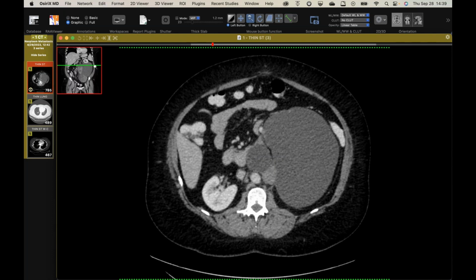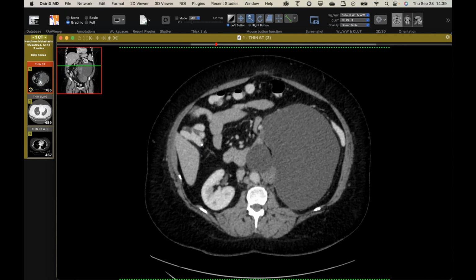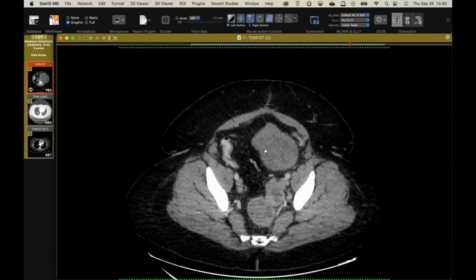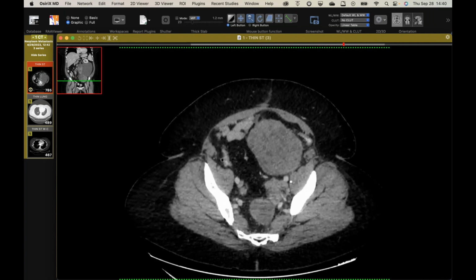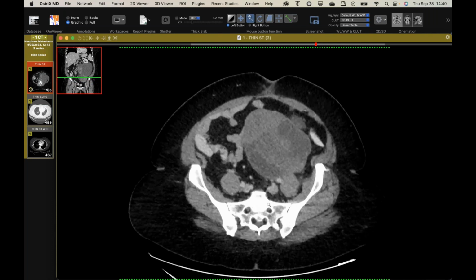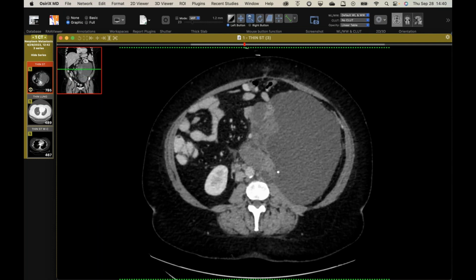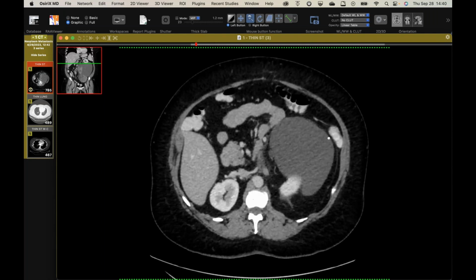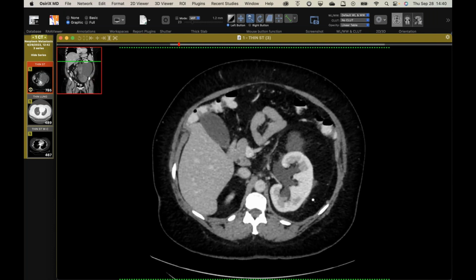So, Jeff, what was the route for the establishment of this big mass? What compartment is this in? Is this adjacent to, bulging up from where the uterus was before? Well, it looks like, I mean, here it looks intraperitoneal. Yeah, because it's anterior to the iliacs there, and there's some of it back here deep in the pelvis. But I presume it just worked its way up the abdomen, and then this big cystic component, which I guess underwent cystic degeneration, which fibroids or leiomyomas do, and it's gotten so big now. As you can see, there's the properitoneal fat, so it's just hanging out in the upper peritoneum. I don't know, and it looks like it's rotated the kidney about 90 degrees, and it's pushing up the retroperitoneum.